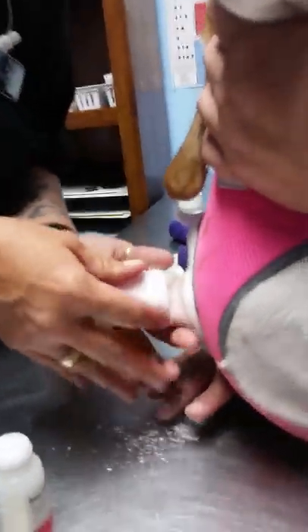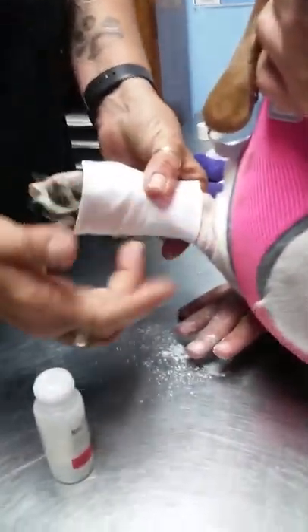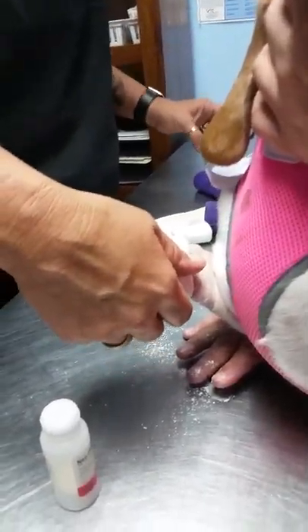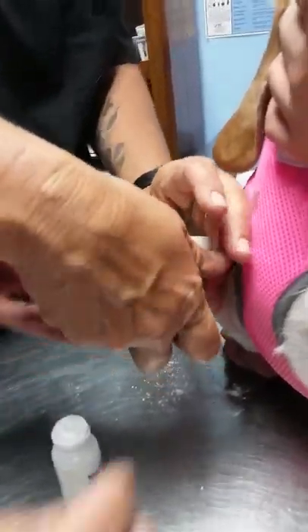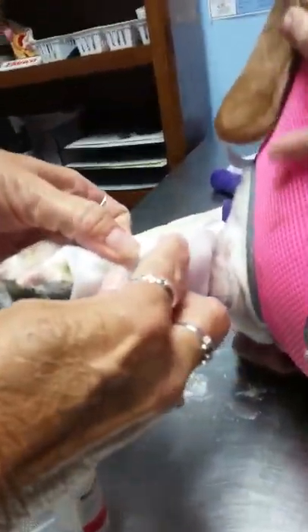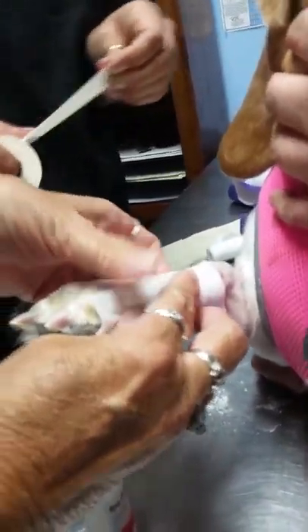So it just covers both areas, the top and the bottom. You fold that first one and tuck it — four by four. She's got two dimensions right there. She has a pad that comes out, so you have two dimensions, and you have to put one under it and one above it.